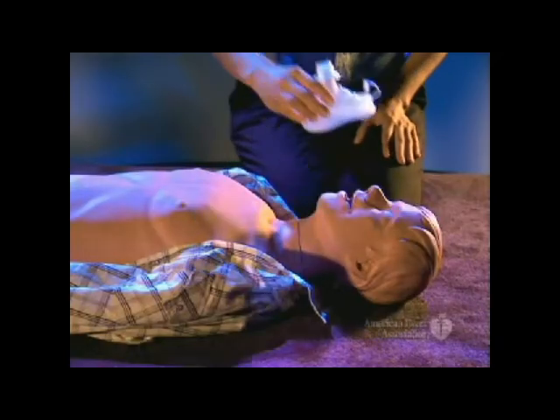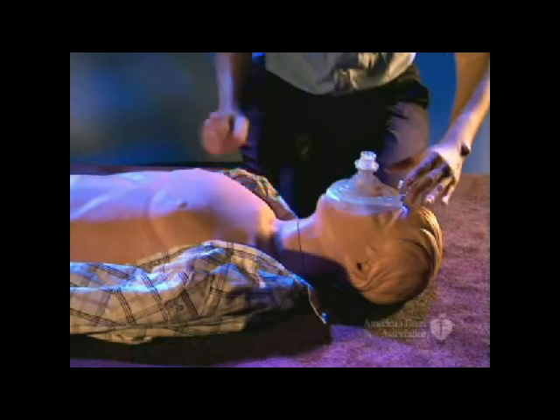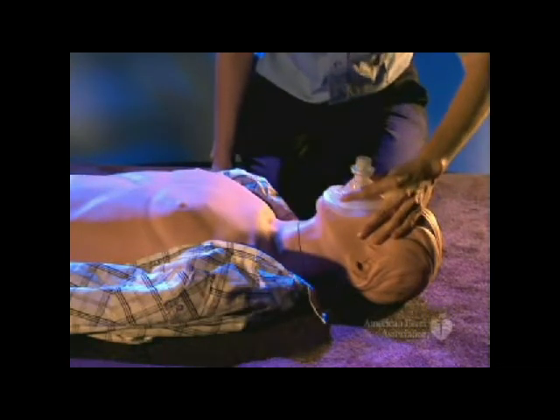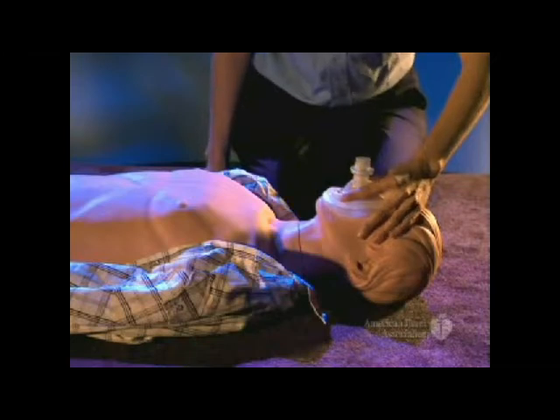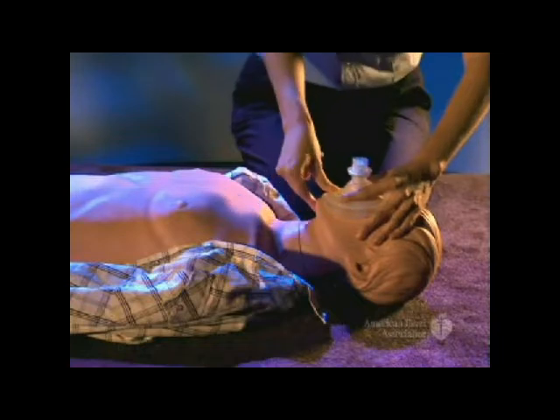Kneeling next to the victim, place the mask on the victim's face, using the bridge of the nose as a guide for correct position. Seal the mask by placing the index finger and thumb of your hand closest to the top of the victim's head along the border of the mask. Place the thumb of your other hand along the lower margin of the mask.